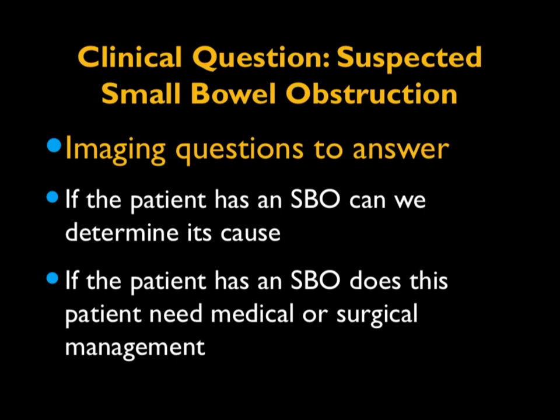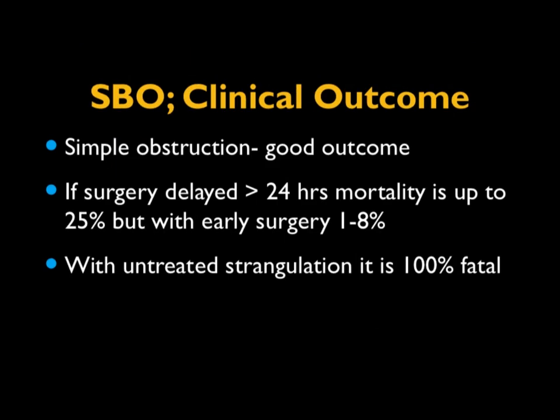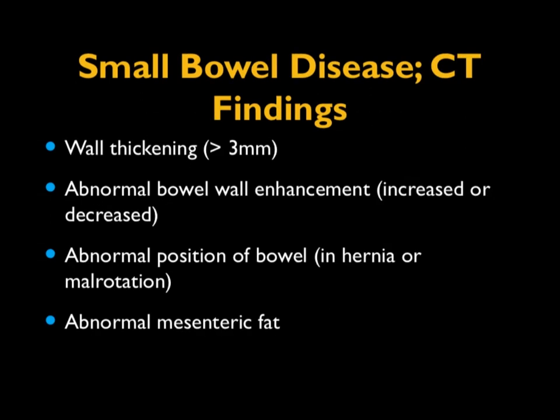Remember now, when you make the right decisions, simple obstruction has good outcome, but if you delay surgery that's necessary for more than 24 hours, mortality rises to 25%. With untreated strangulation, it's literally 100%. Now, what do we look for?